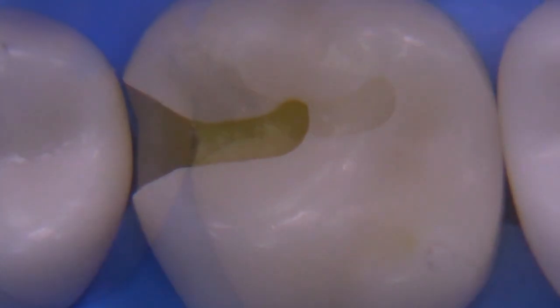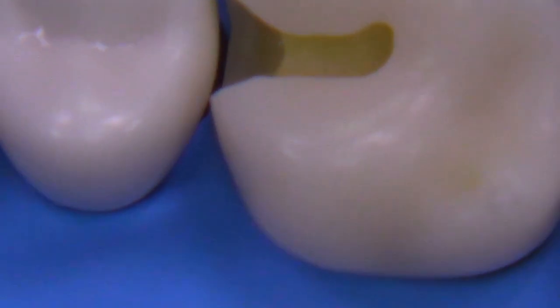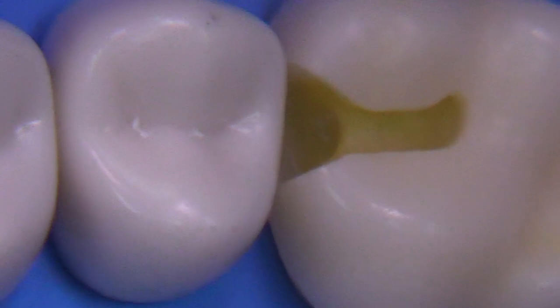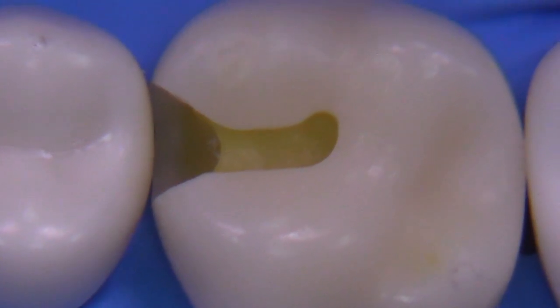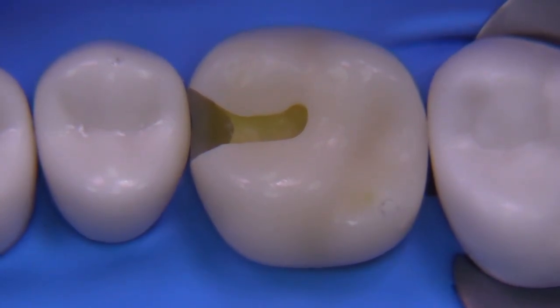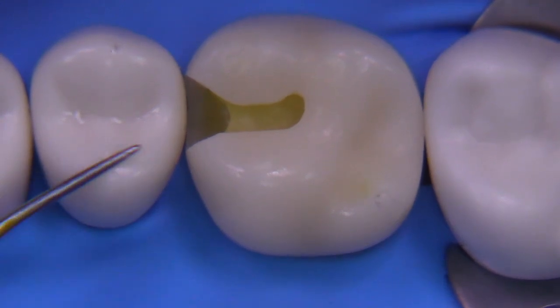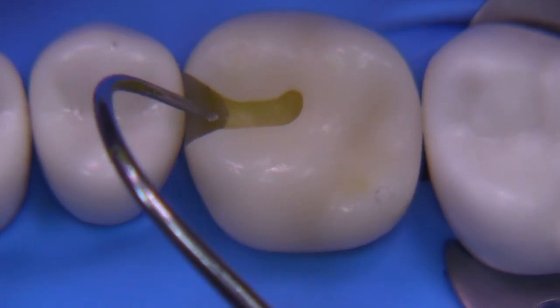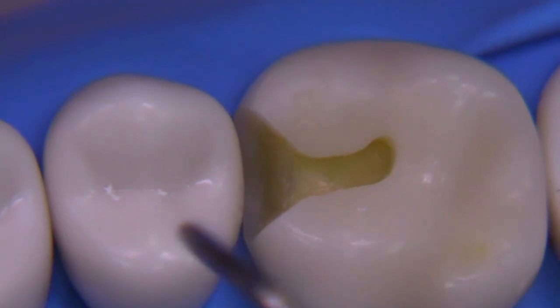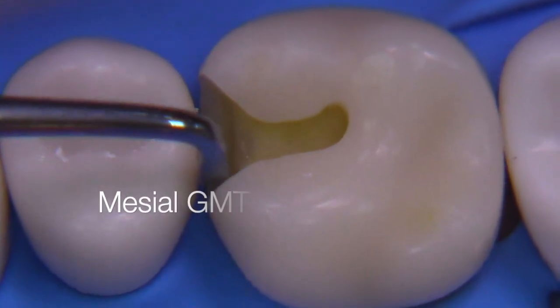In private practice, this would be it — I'd be finished. The extensions are just enough to break contact and we have a preparation that's not too deep axially. It's not like an amalgam — it's kind of a concave look — but I would go ahead and place my composite at this point. However, I want to take this preparation a little closer to a board exam, where they're asking for at least 0.5 millimeters of space between your outline form and the adjacent tooth. Some people like to place a base on the axial wall to build it back, so I went ahead and did that using a flowable composite.